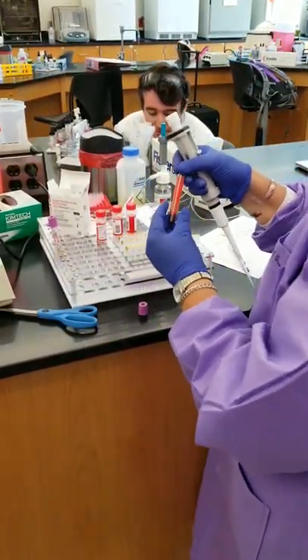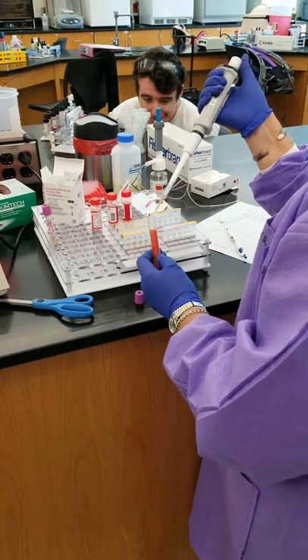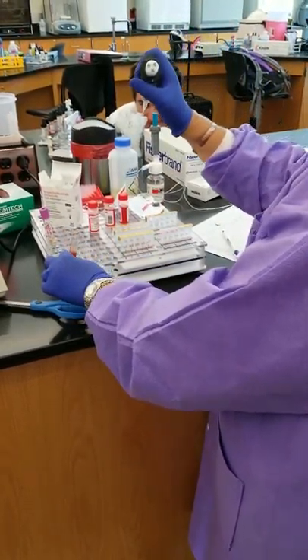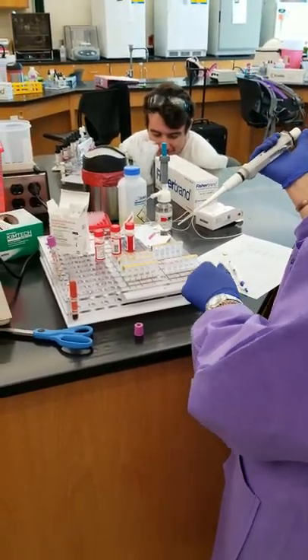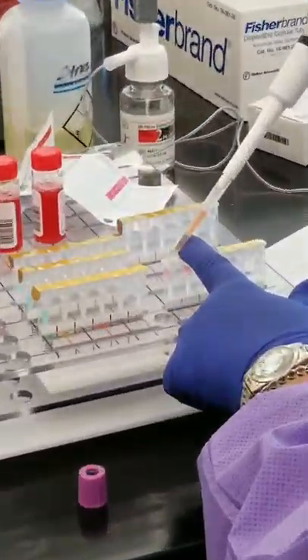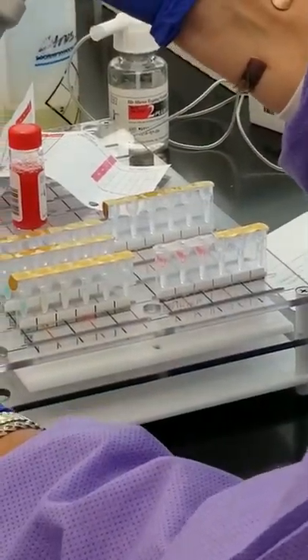Okay, so I'm going to go into my plasma. I'm going to draw up some of my plasma, dispense the first little bit back. This is 25 microliters. The first one was 50 and now it's 25? Okay. So I'm going to do the same thing. I'm going to dispense 25 into each one of my wells.